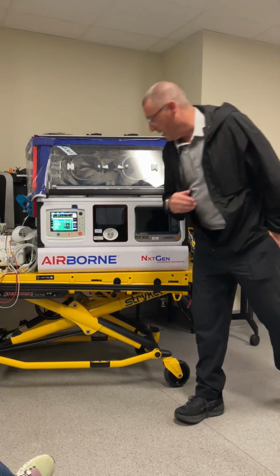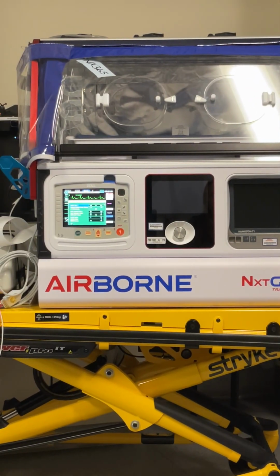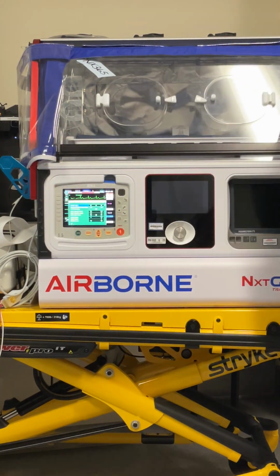Well, let's say your heart rate is 220, and you're comfortable with 220 for that patient, but you don't want it to be alarming the whole entire call. The top quick access key says stat set. Hit stat set. What happened to your alarm parameter for that one now? Now what are your alarms? It's going to auto adjust 20% above and below what's currently on the monitor. So that 220 is now going to be normal, it's not going to alarm at it, but if it goes above that by 20% or below that by 20%, it's going to alarm.